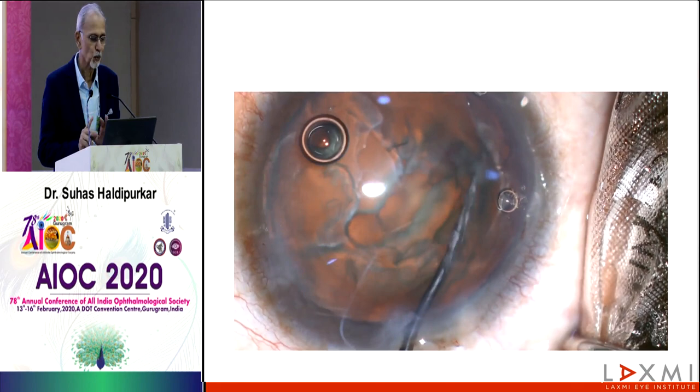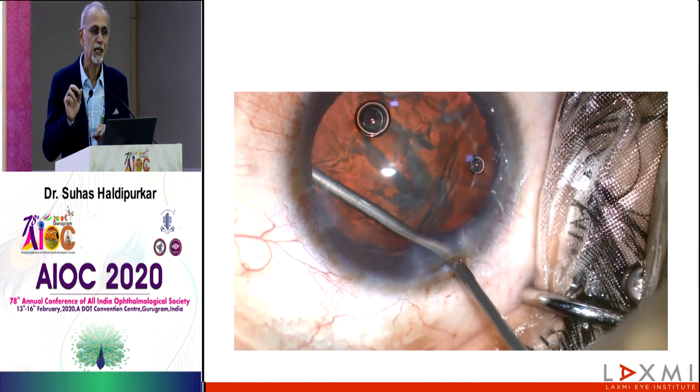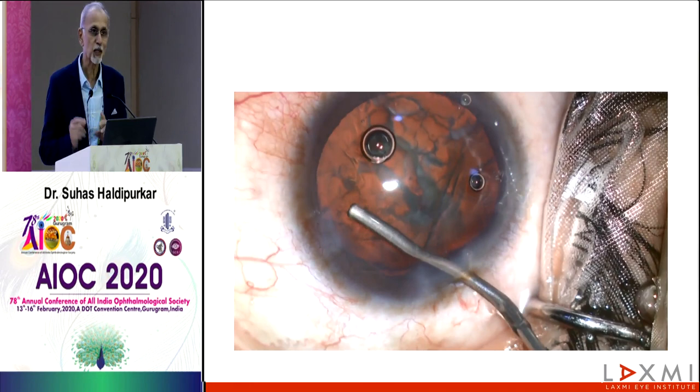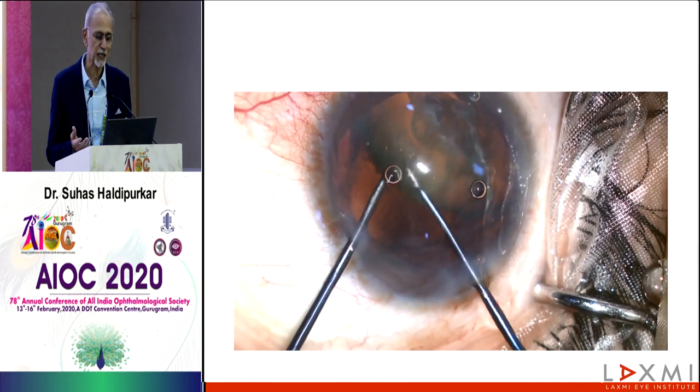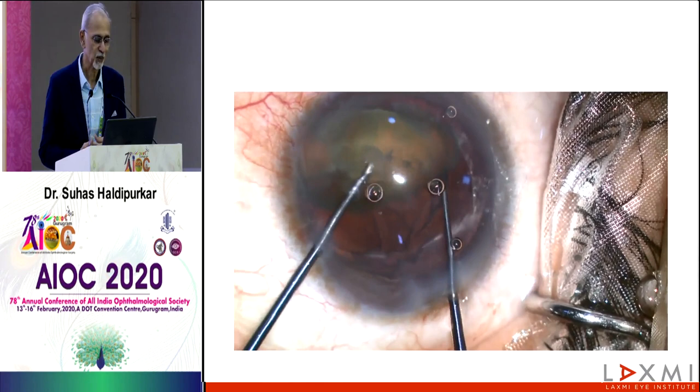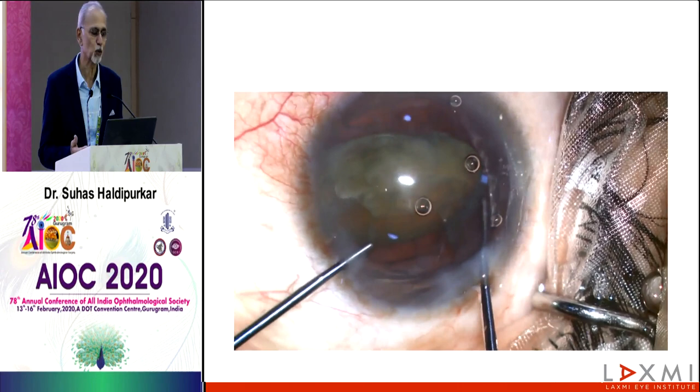What I do, I come out, rotate the nucleus, get enough amount of viscoelastic, and inject it behind. Now, that is your saving grace. You find the rexis, you find the gap, inject viscoelastic, and then the best thing you do is use the two instrument technique, rotate it out, and get the lens on top of the bag. Once your lens is supracapsular, then half your battle is won. Then you have various techniques.